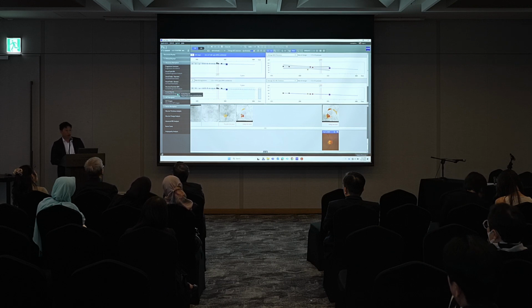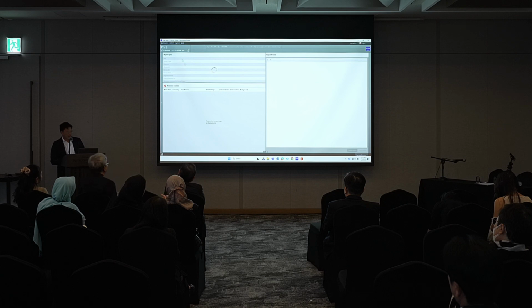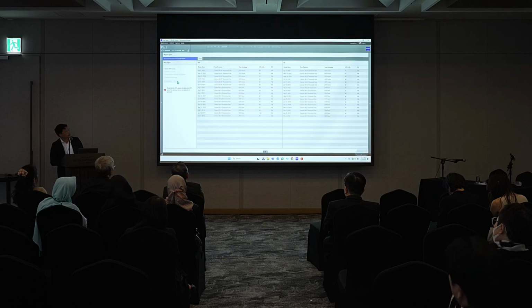And so if you've got well-trained nurses, they should be able to do this for you, or to do it on Cirrus. But just to work through that, we can actually left-click on Create Reports. And the one thing that comes up is typically structure function. And so I instruct all my staff to create this report for me for every new glaucoma patient. And that's basically the summary of all the things in one. So here we're just going to work through that.